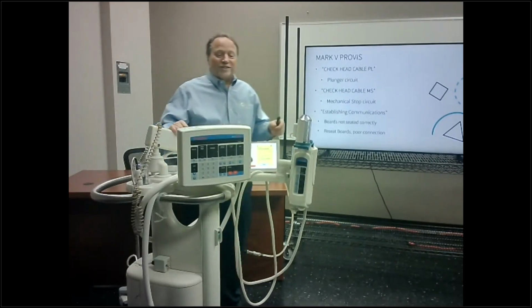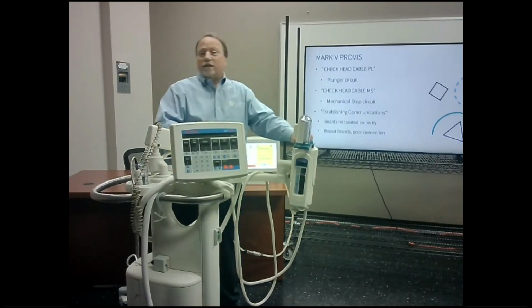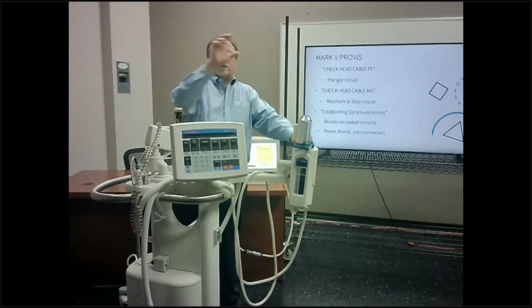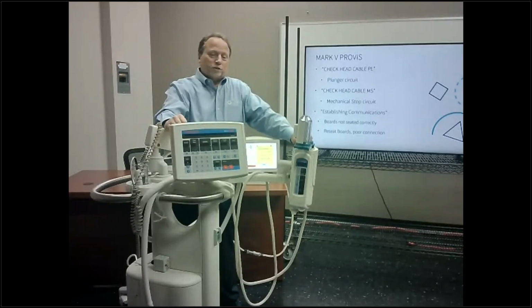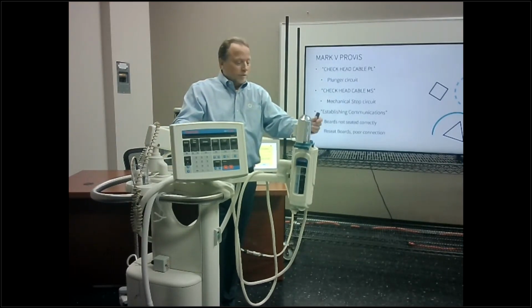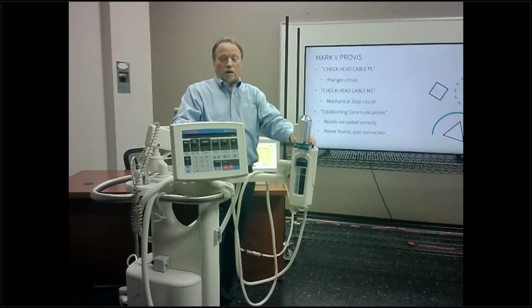Establishing communication, that's a good one too. You turn it on, it just says establishing communications. The injector head turns on, but nothing else happens. It just sits there and says establishing communications. Reseat your boards. Down underneath in the control cabinet, reseat your boards. They normally don't get pulled out and so-called cleaned. Some of us old timers remember that if you reseat boards and clean up all the contacts on them, just doing that can solve your problem.